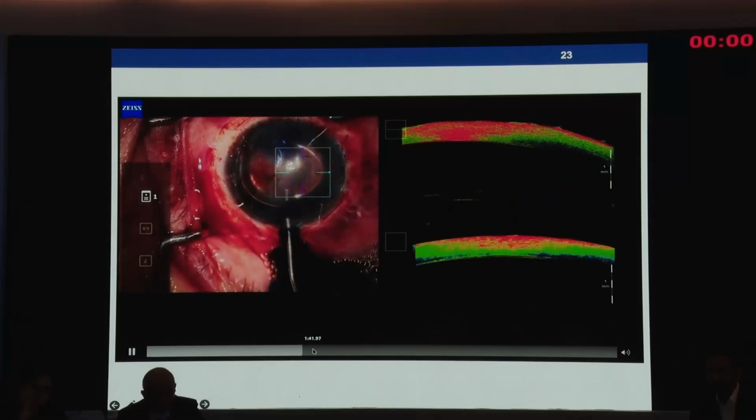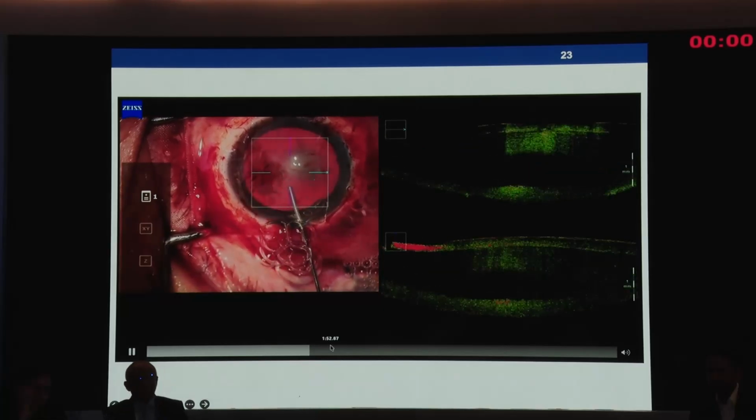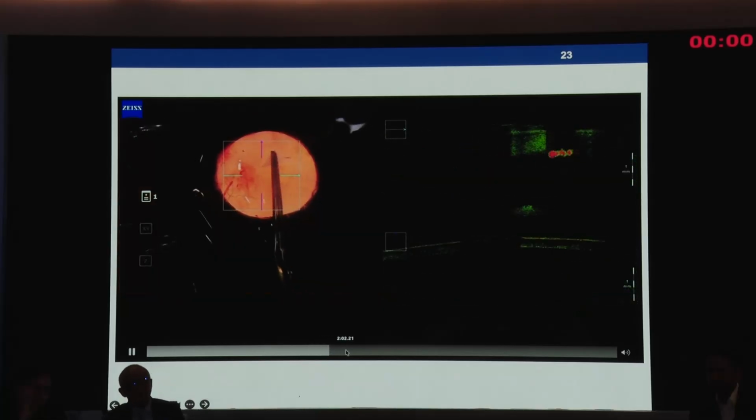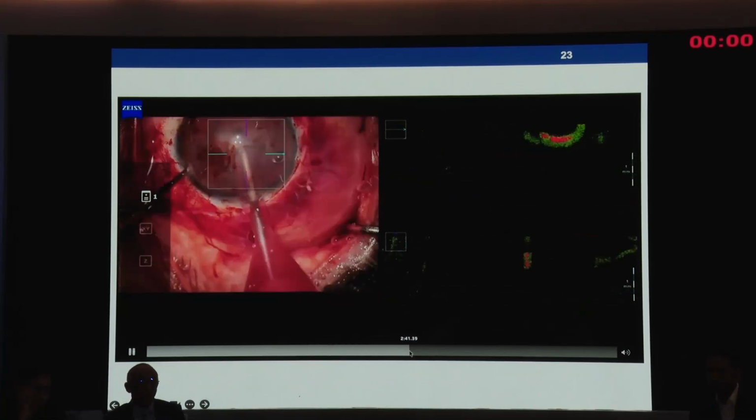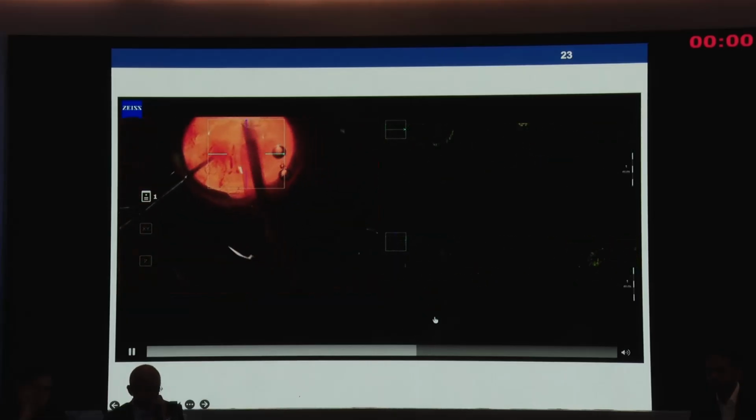And then subsequently, now because it has become a lot clearer, you can shuttle between the chandelier and the normal operating microscope light, and rhexis is being done here, which can be very clearly seen. Then once you put the chandelier on, everything brightly illuminates.